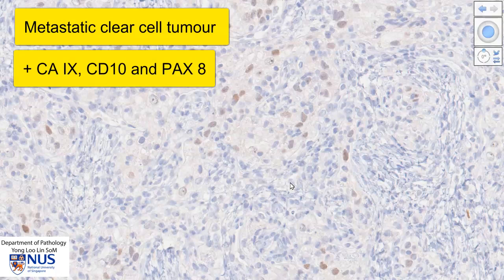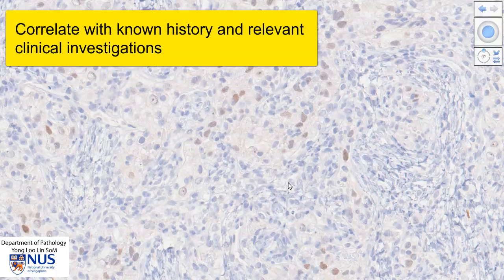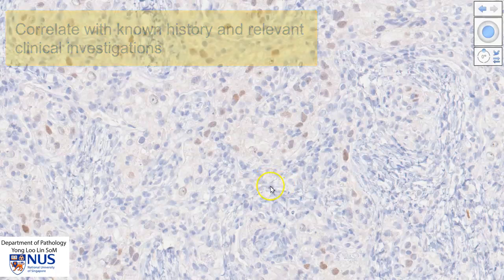This immunoprofile, or immunophenotype, is compatible with metastatic clear cell renal cell carcinoma. It would also be important to correlate this finding with a known history of renal cell carcinoma, or with current investigations if this is the first clinical presentation.